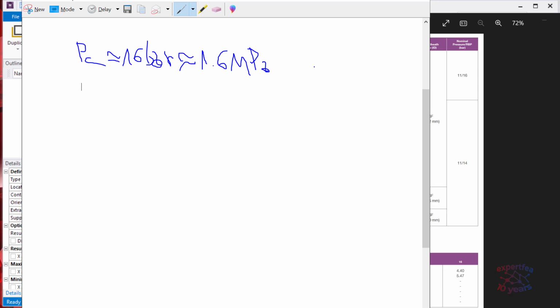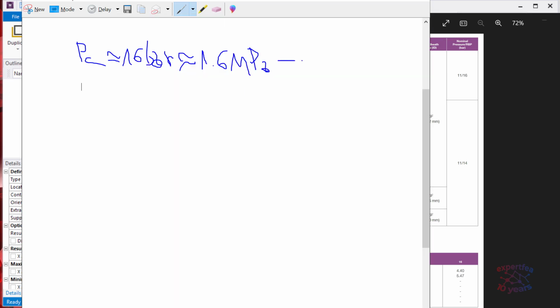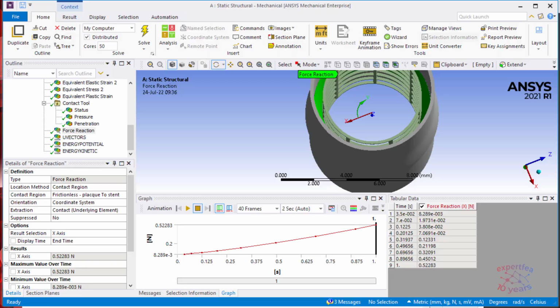And in order to make a correct correlation, let's change the displacement. Instead of 0.35, let's make it 0.23 as prescribed here. So this should mean that it is applied as radial displacement 0.23, instead of what we have now, 0.35 millimeter. So the first step would be, let's remake the FEA with 0.23.